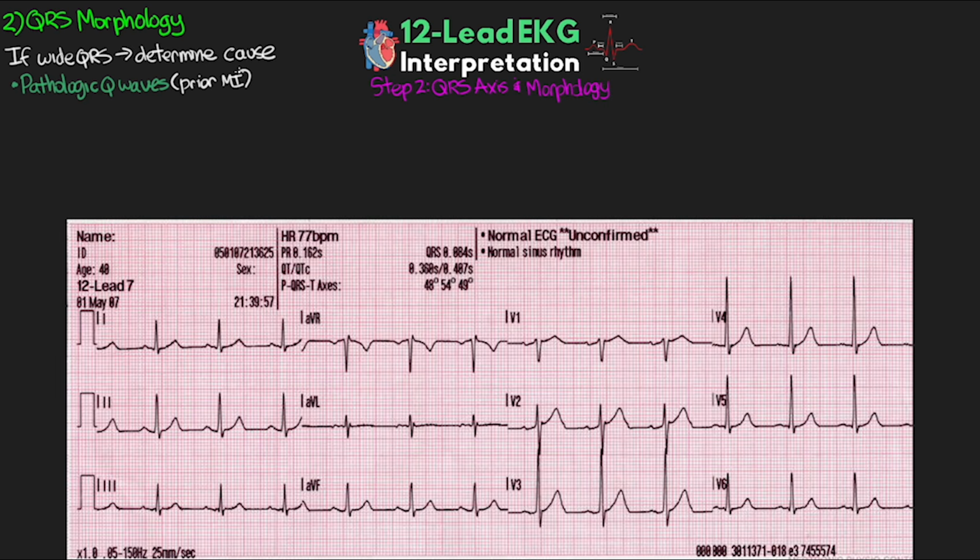Now, I'm really not going to cover this much in this lesson here, as this gets a bit deeper into EKG interpretation than I really wish to go here. But certainly feel free to look more into this, as it will help to further your knowledge of EKG interpretation.